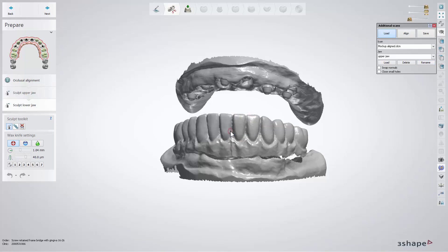The Swap Normals tick box improves the visual qualities of the scan and it usually should be used for third-party providers' scans. The Close Small Holes option closes them if necessary.